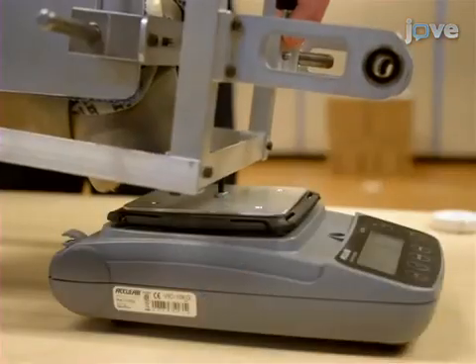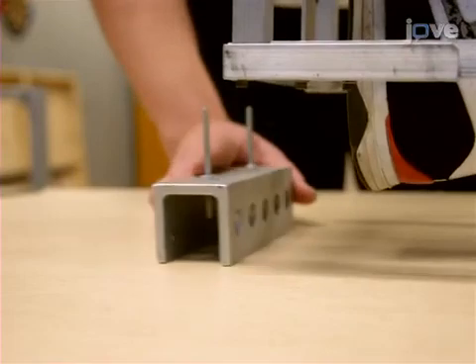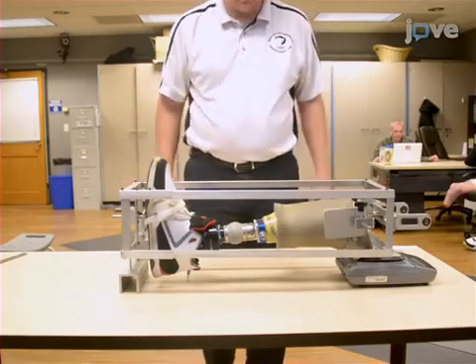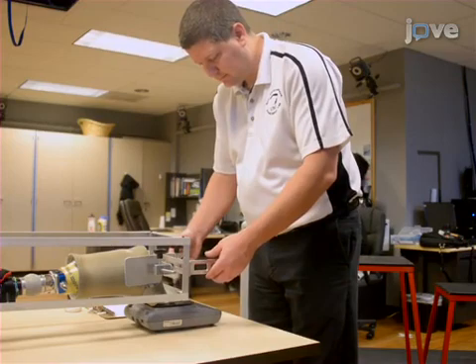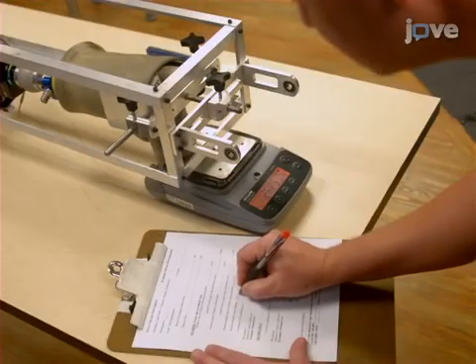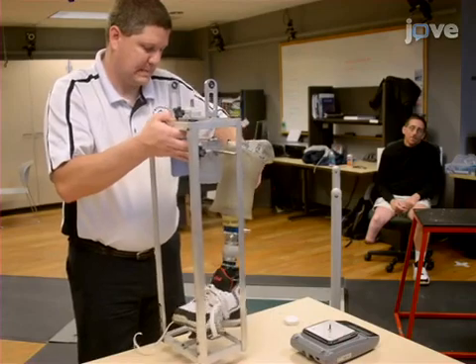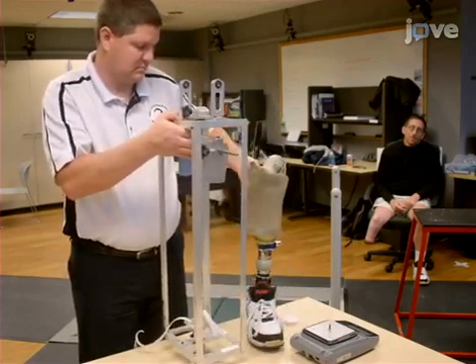Then, place one end of the inner cage over the scale, and position the knife edge at the bottom of the inner cage so that it is level and there is no tension between the two knife edges. Lift the scale end several times and place it back down on the scale. Record the value once a consistent reading from the scale is achieved. Next, remove the prosthesis from the inner cage and record the reaction board reading for just the cage.